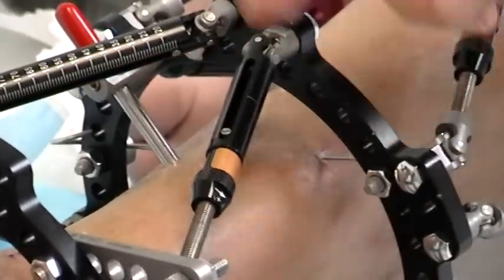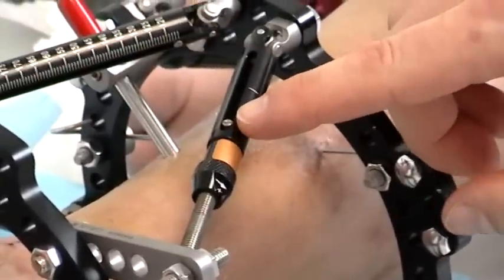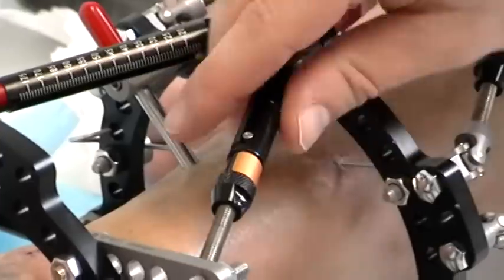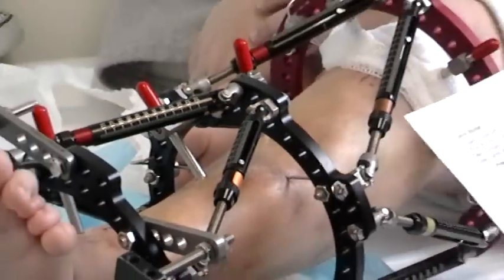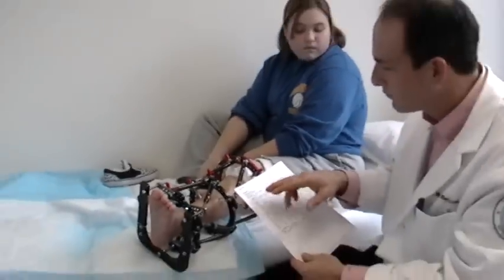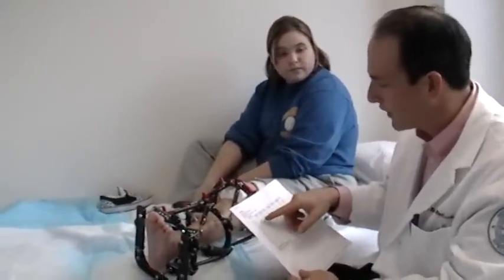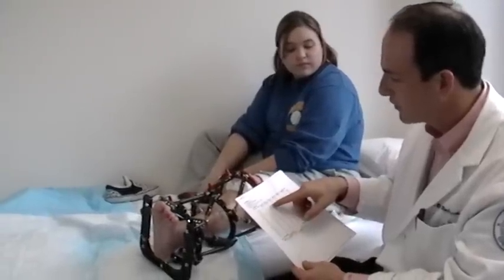One full revolution of this turning knob is equivalent to a millimeter on the strut. In general, what we like to do is have you break up your struts over the course of the day — do struts 1 and 2 in the morning, 3 and 4 in the afternoon, and 5 and 6 in the evening.